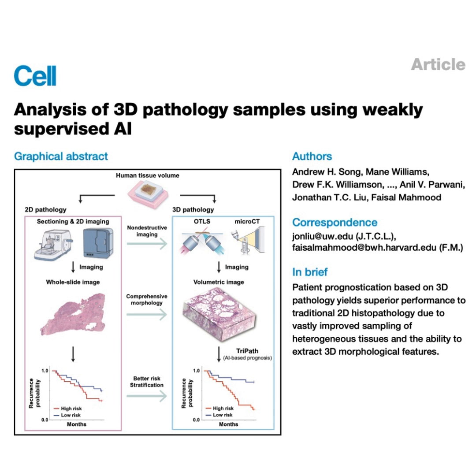But interpretability is key for AI in medicine. We need to trust it's not just a black box. How did they figure out what features TriPath was learning? Yeah, absolutely crucial. They use a technique called integrated gradients, or IG. You can think of IG as a way to ask the AI, okay, you made this prediction. Which parts of the input image were most responsible? So it highlights the important bits.